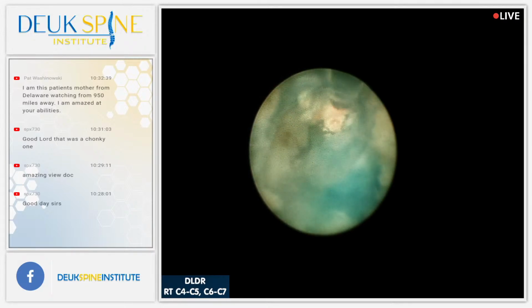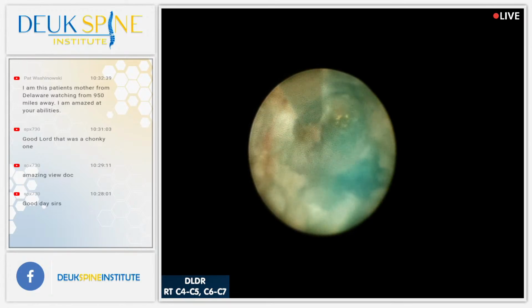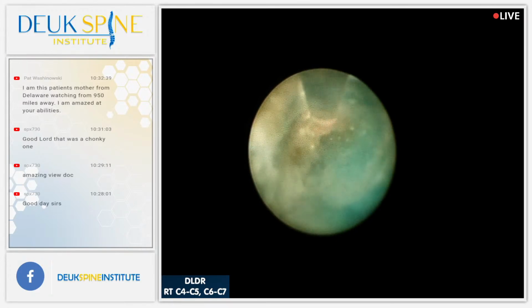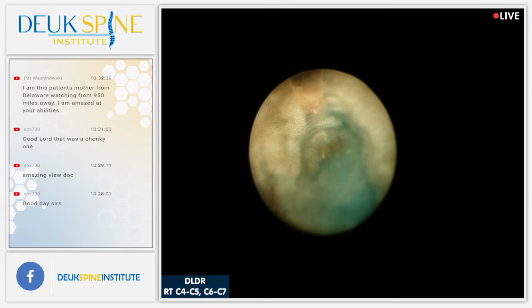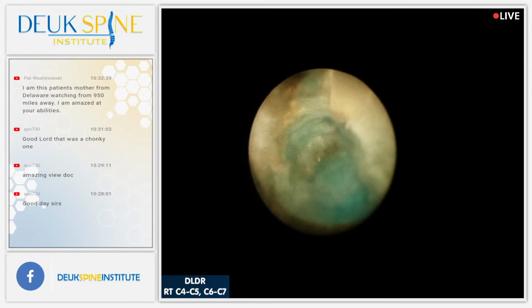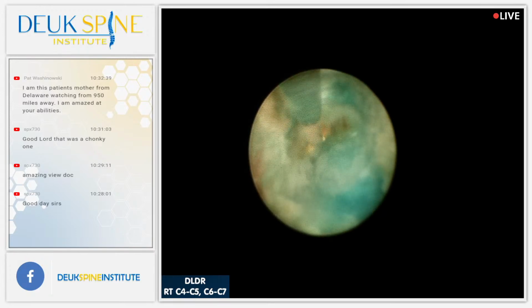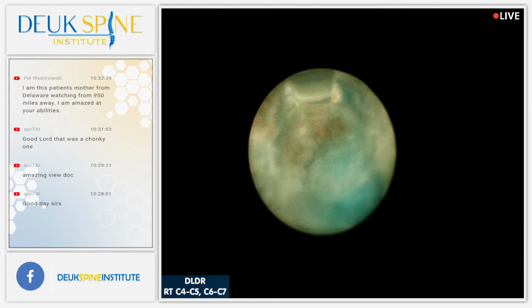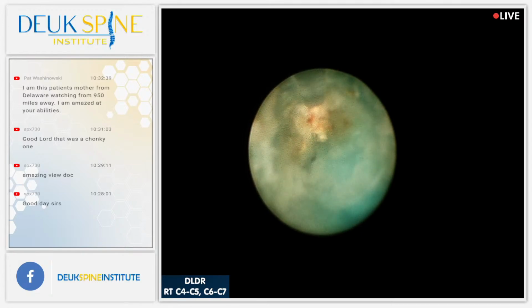All right, this is embedded in the spinal cord. This is far worse here that I'm looking at. It's worse than his MRI showed. His MRI didn't show it this bad, so he's clearly progressed. Okay, there's PLL. I'm cutting the PLL, and this stuff is all in the epidural space. Once you go past the PLL right here, you are literally in the epidural space, and there's a huge herniation. I mean, we've taken out so much, and look at the calcium. So he literally shot this thing out.